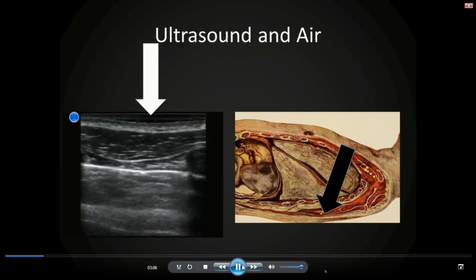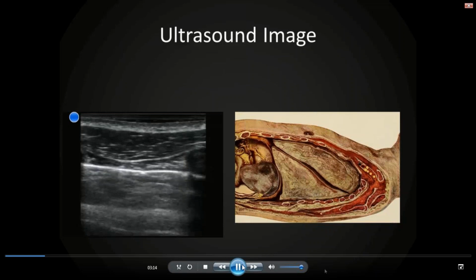On the left image, the same process happens. Ultrasound beam comes down, goes through the skin and deeper. The part that we can really see and get any information about starts right here at the skin level, and for all intents and purposes usually ends at the pleural line level. Below that, the lung is just too well aerated and we don't get much information. And here's the comparison on the left. This is actually ultrasound gel. This is the skin, subcutaneous tissue. We start having some fat here, muscle. This is mostly muscle. And here we have ribs.